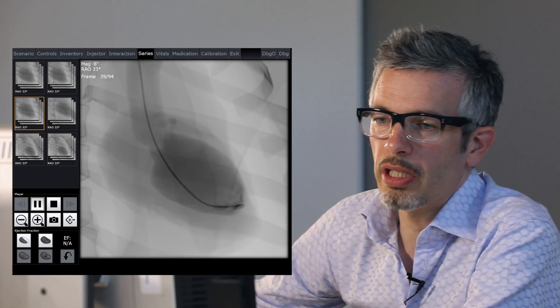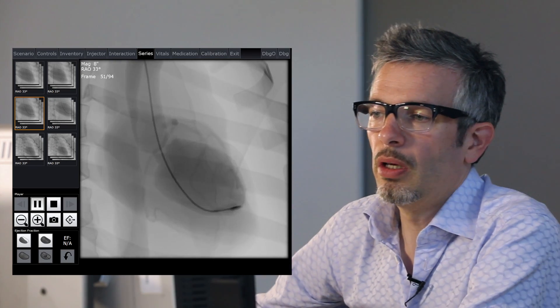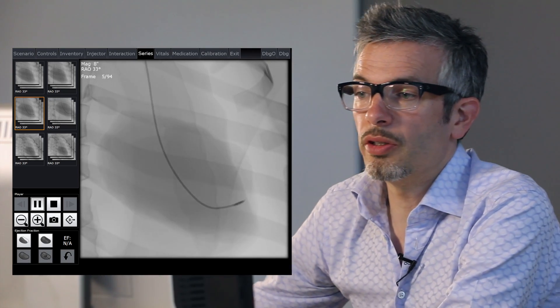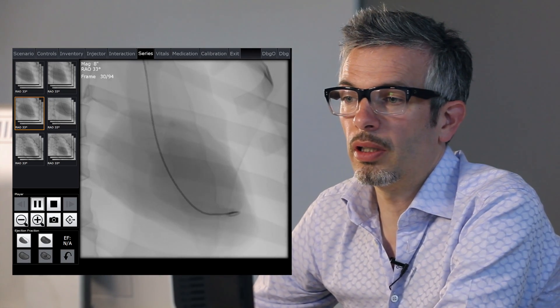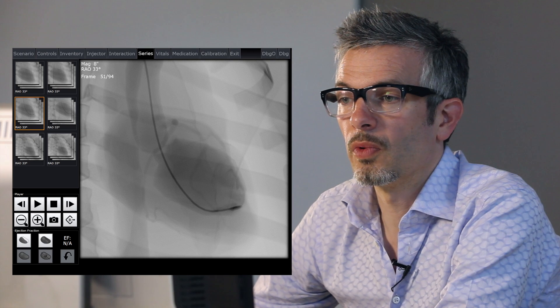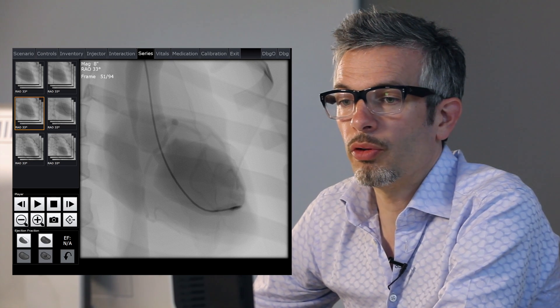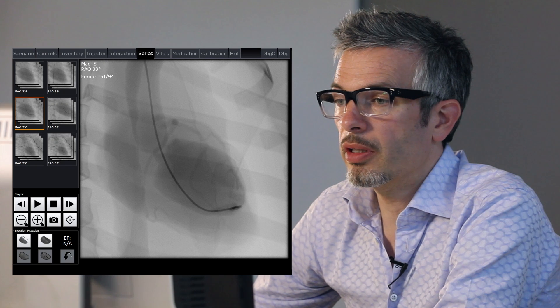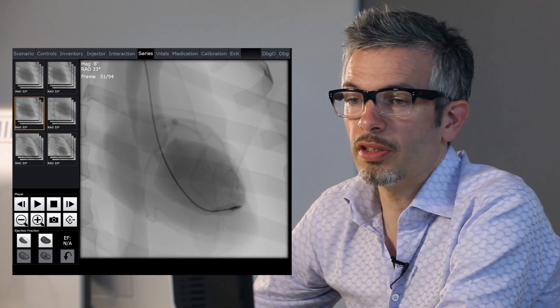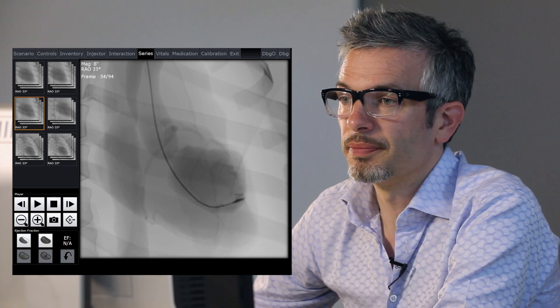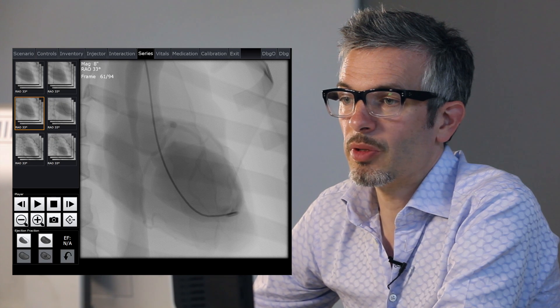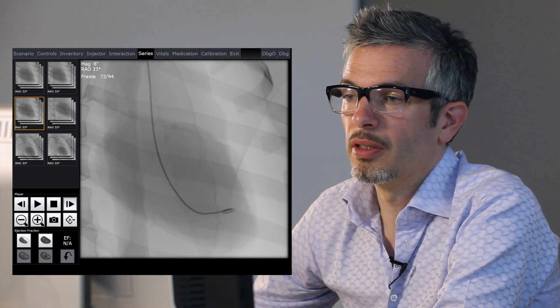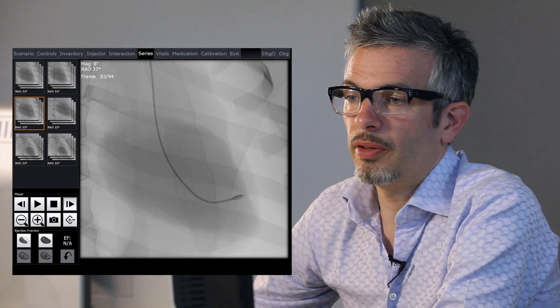I'll show you now how to do the measurements for looking at ejection fraction. The first thing we need to do is pause our cine loop and go through frame by frame until you find the frames of systole and diastole — so we're looking for the maximum size and the minimum size.